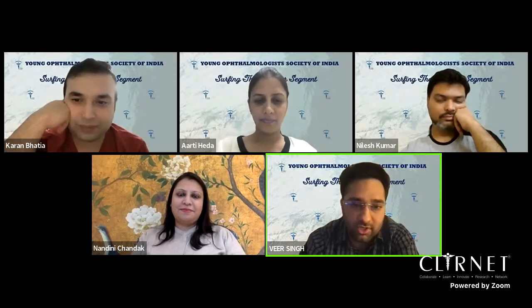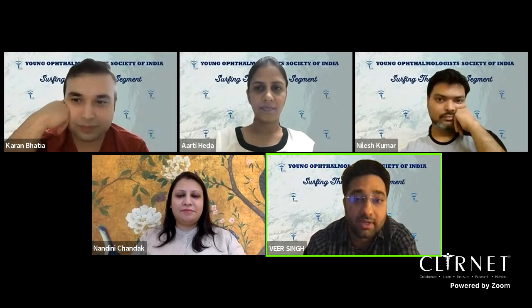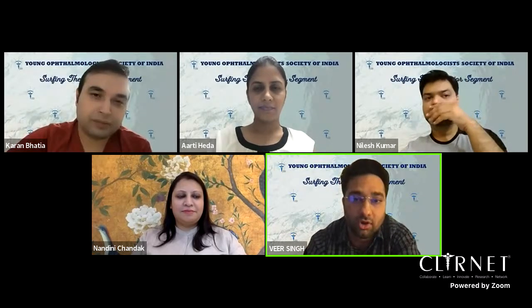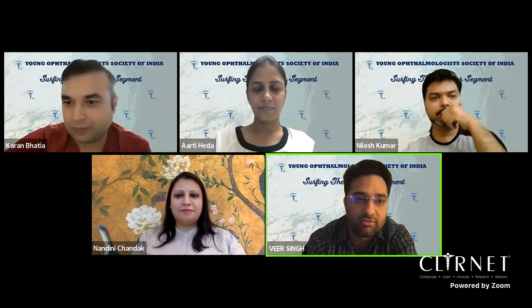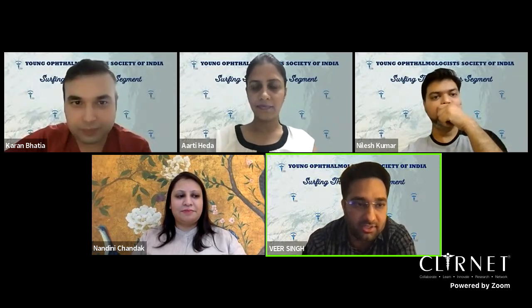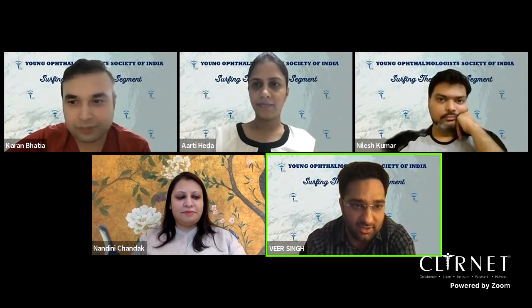Another downside I have noticed is that since it's a hydrophilic material, there's a lot of iris pigment on it in some cases. And the third thing is we don't know about the long term, because a lot of hydrophilic IOLs have been known to become opaque. If that happens, what we're going to do with the fibrosis and everything, we don't know at the moment. So I think the only way is the hard way. There's no shortcut to learning the SFIOL technique, and keep practicing, I guess.